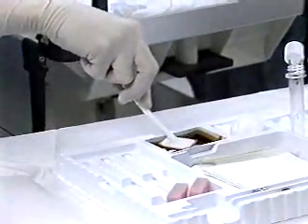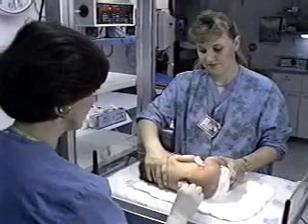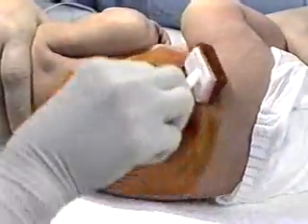Next, the practitioner preps the area over the puncture site with a standard sterile scrub, moving from the anticipated puncture site in a circular motion out to the periphery. The area is scrubbed 3 times with betadine and allowed to dry. The iliac crest area should also be prepped if a second drape is not used, as will be demonstrated here. One sterile drape is placed underneath the neonate.